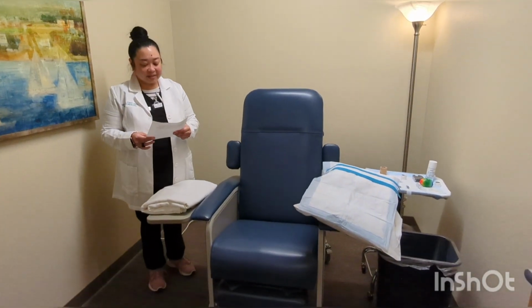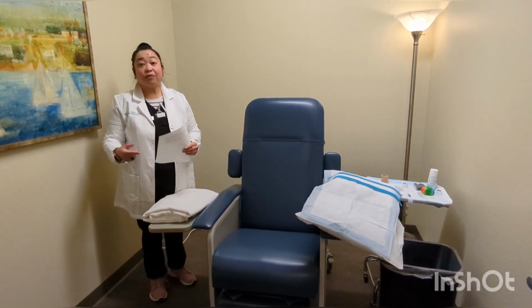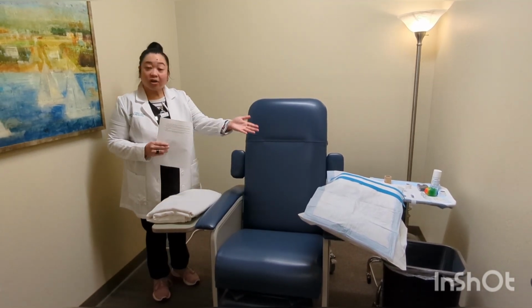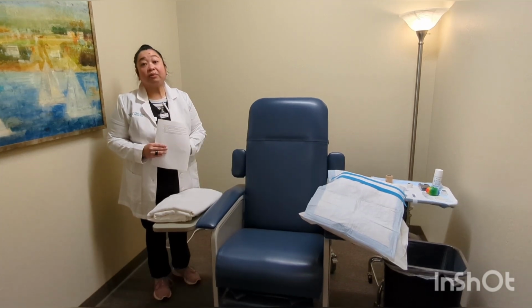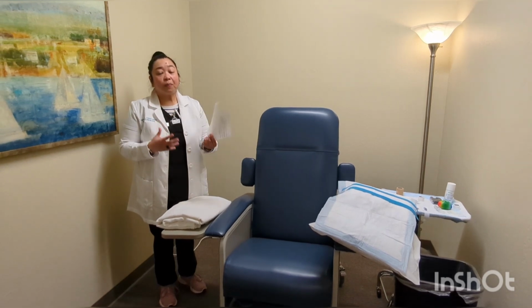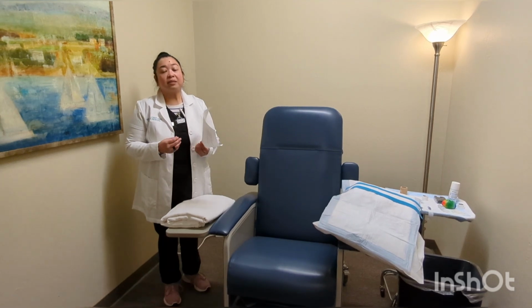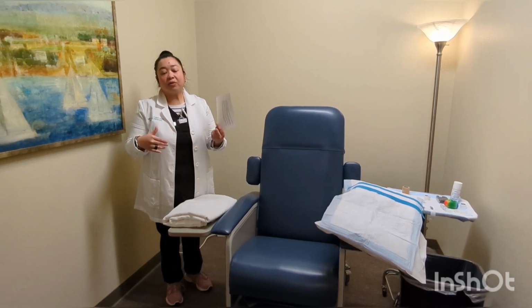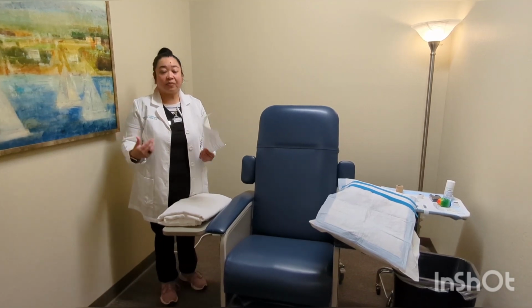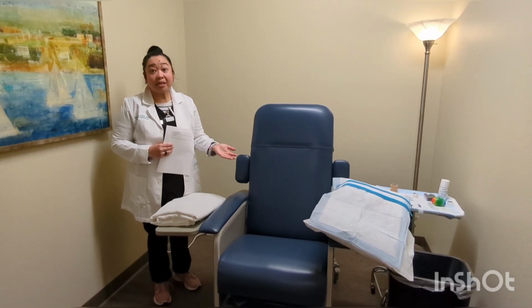The second scan is called the baseline scan. Patients typically return the next day for the second scan, and they sit here. I start an IV once again because the tracer does not remain in the system. It's important to note that we require our patients to wait a minimum of 24 hours before we can scan them again, because we need to make sure that their system is clear of the tracer from the previous scan. Once I've established an IV, the patient will rest here for 10 minutes.